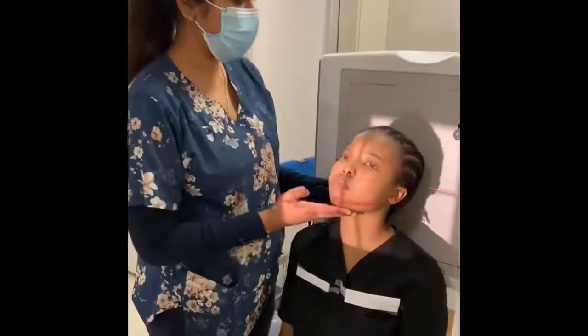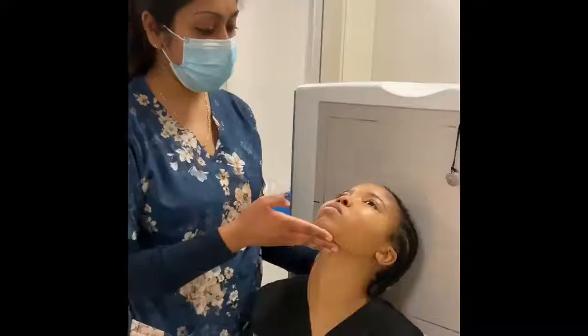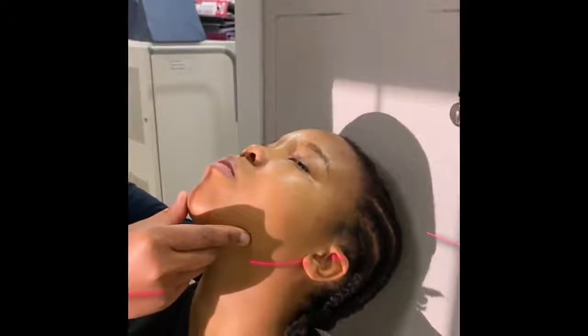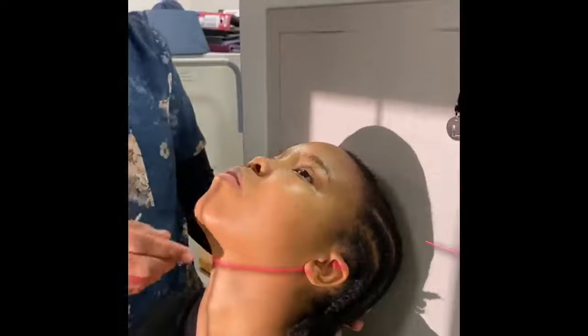Okay, so let's try and extend our patient's head. We want the IOML, which is this line here, to be parallel. So you even extend your patient's neck even further so that the vertex of the head is actually against the image receptor.